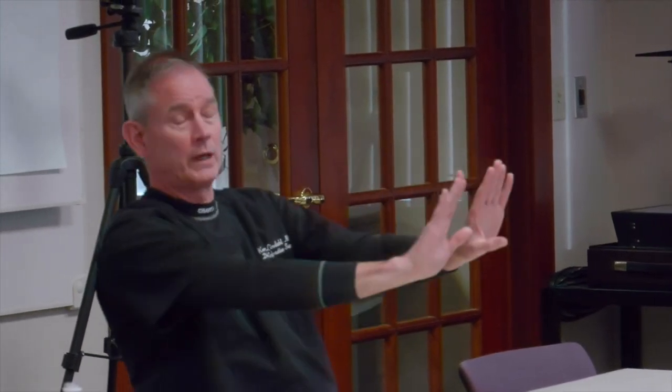Usually once you've done one eye, let's say you start nearsighted and we put in the lens to make you good at distance, which we're always going to do, there's an imbalance between the two eyes. So we can do the other eye even if it has very little cataract to bring it up. Okay, does that make sense? Yes. So in certain circumstances, you don't have to have a bad cataract to have us take it out.